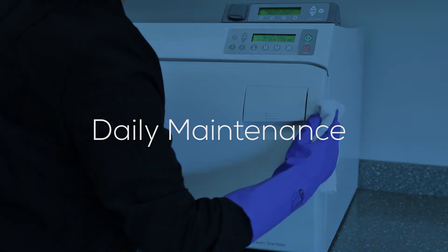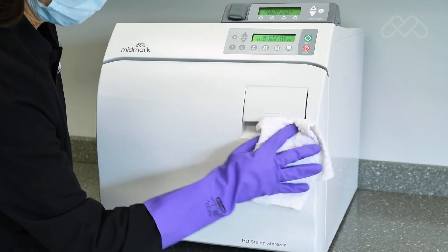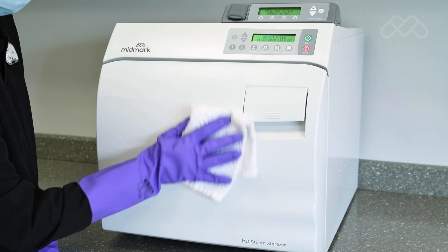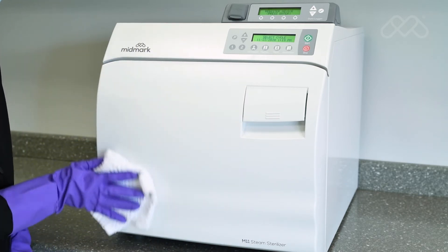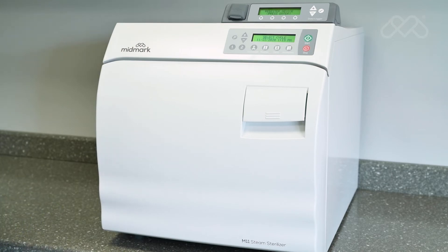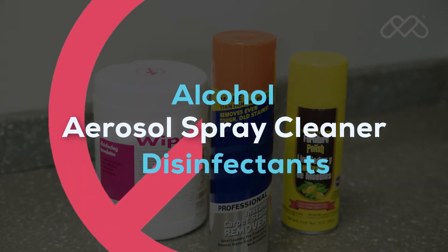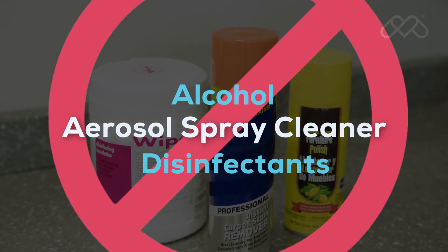Wash the exterior of the sterilizer each day with quaternary disinfectants according to your facility's procedure for clinical contact surfaces. Staining, pitting, discoloration, or softening could occur if phenolic, iodophor, or glutaraldehyde-based disinfectant is used on the plastic surfaces of the unit. Use of alcohol, aerosol spray cleaner, or disinfectants containing substantial amounts of alcohol can also damage the sterilizer faceplate.